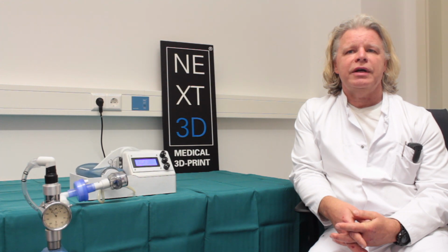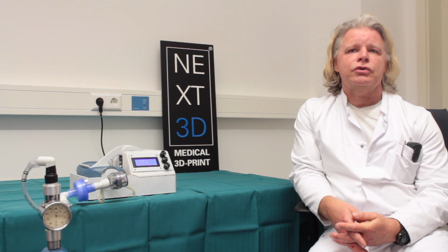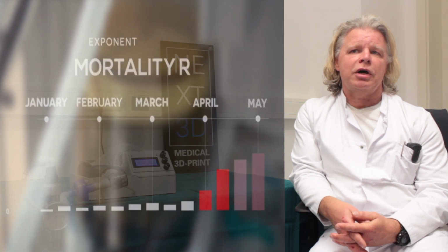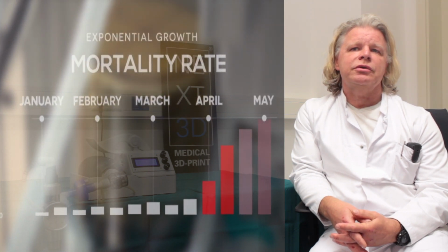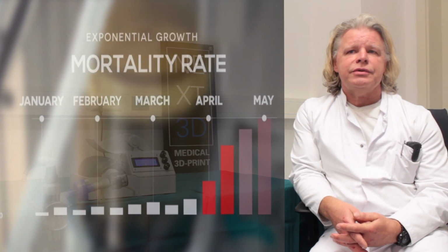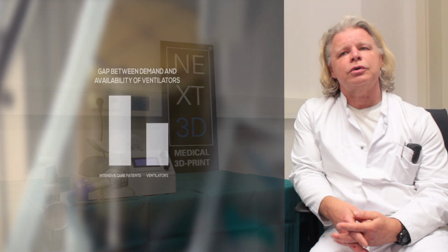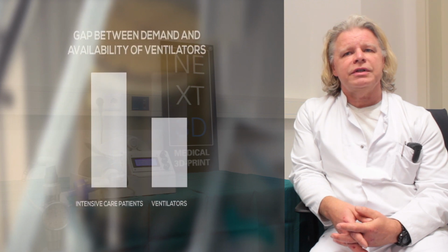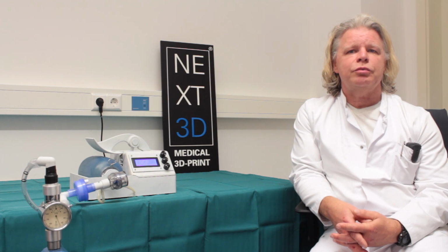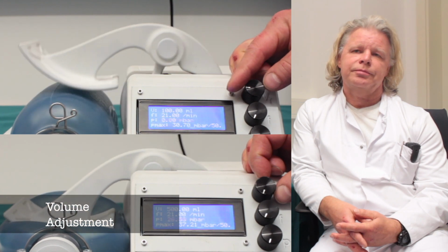Symptoms of lung failure are a very rapid breathing, exhaustion of breathing performance, and a drop in the oxygen partial pressure in the blood up to cyanosis. The most traditional and most frequently used and established mode of artificial ventilation is volume-controlled ventilation. This form of ventilation guarantees the application of a defined breathing volume and a defined amount of oxygen.